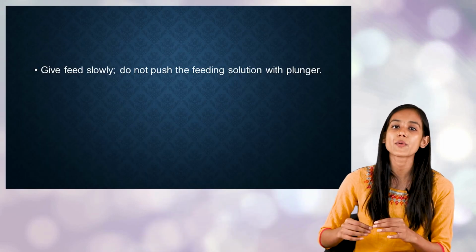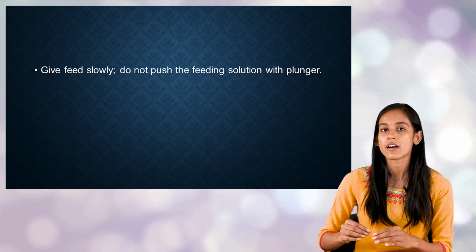So we are going to pour the liquid in the syringe, and till that time we have to pinch the tube, we should not leave it. Once we pour the syringe with the nutrients, we are going to release the tube slowly.